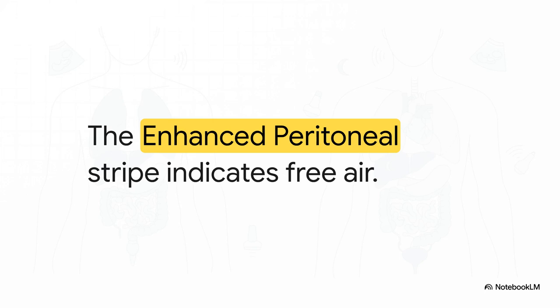The source material also drops a really cool pro tip, especially for penetrating trauma. If your abdominal views are getting totally washed out by repeating bright echoing air stripes, don't just blame poor technique. Be highly suspicious of pneumoperitoneum. That's free air in the abdominal cavity, presenting as the enhanced peritoneal stripe sign.